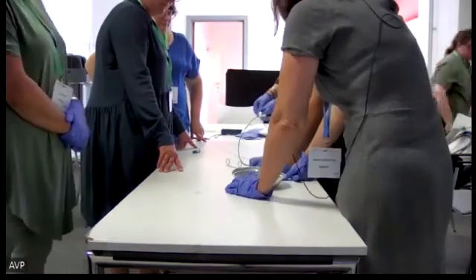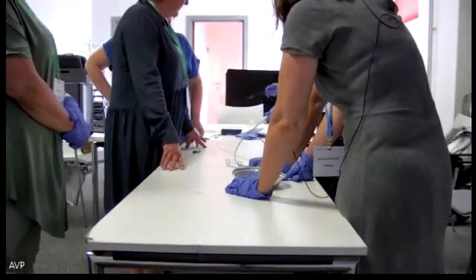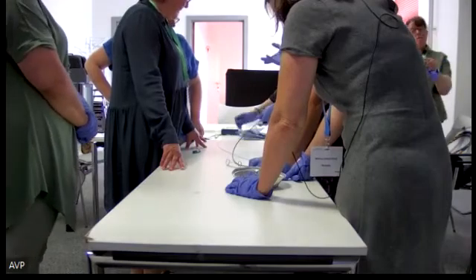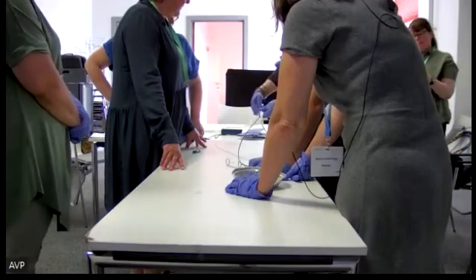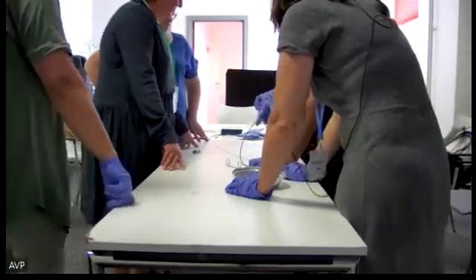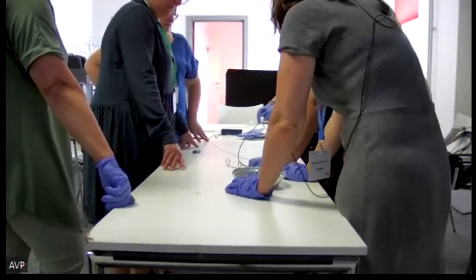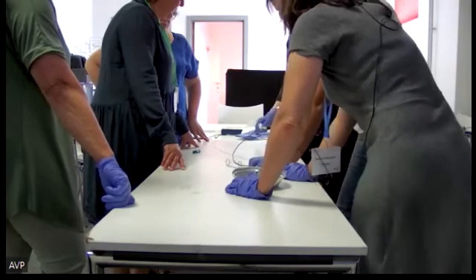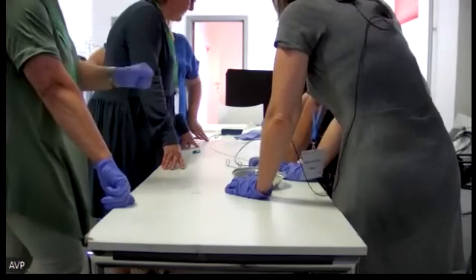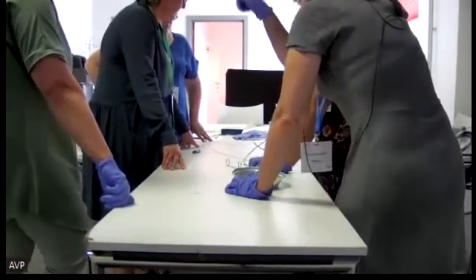When we are in the cyst, we remove the inner. We can push. Then it's a needle. Like a needle, you aspirate the liquid, the liquid going to the pathologist, or sometimes chemistry culture. Do you use contrast? Yes, sometimes. Of course, but with the guide wire, we have a good position.